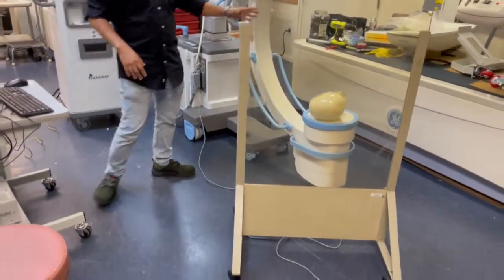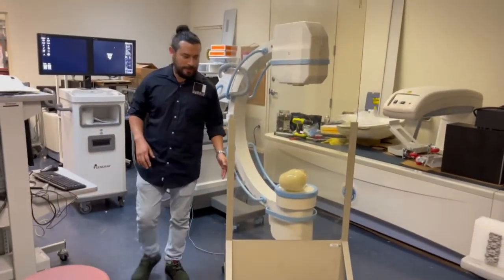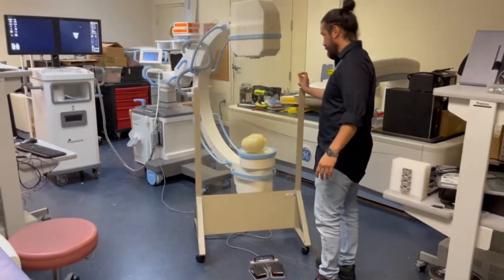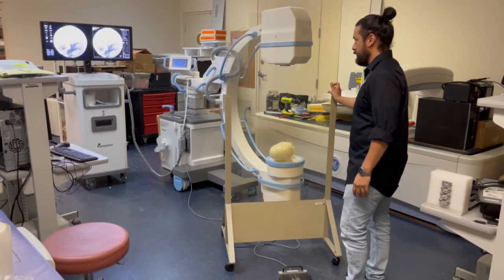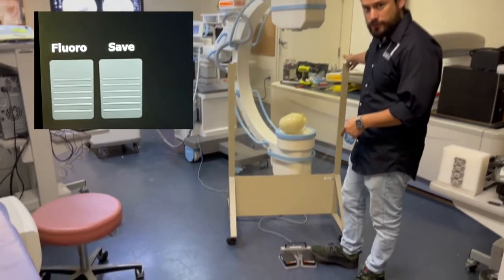We're going to take a shot at this Phantom so you can see the image quality. You can also save from the foot switch.